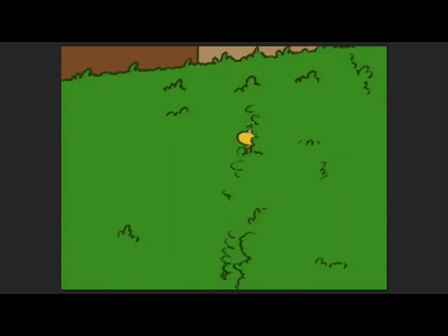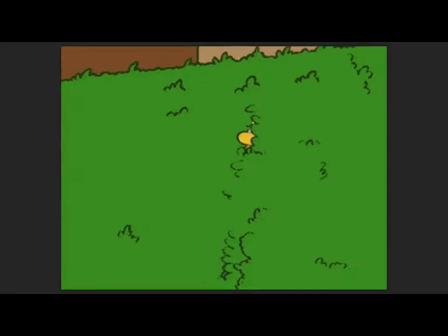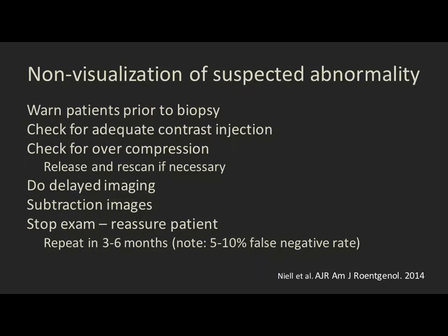Challenge number five: the disappearing lesion. Unfortunately, this happens not infrequently — a lesion you saw on the diagnostic study you no longer see when it comes to biopsy. This can be for many reasons, including that image quality is often not as good on the biopsy studies, or if it's related to fibrocystic or hormonal changes, it may truly have disappeared. If I see the lesion at all, even very faintly on the biopsy study, I will go ahead and biopsy it. It's really important that you warn patients about this possibility prior to doing the biopsy — it's really tough for them if they're all set up and then you suddenly call a halt without them having had that preparation.